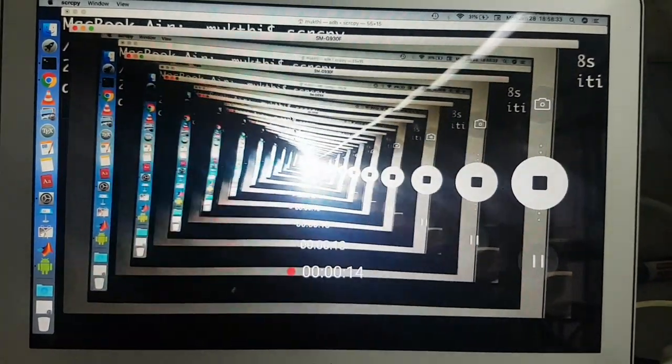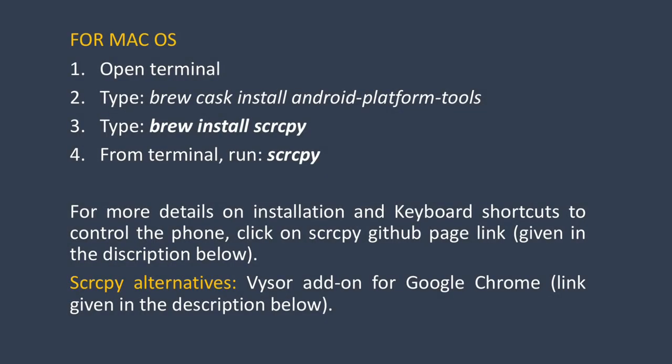So I was recording from the same phone which I have connected, and yeah, you can have some fun like that where you have some weird patterns. So like scrcpy, you can use any other app. I prefer scrcpy because it's smaller and can run on multiple platforms, but majorly because it actually has some really cool keyboard shortcuts like Control H for going to home or Control B for going back. And even in Supervision, you have the up and down arrow keys for zooming in and zooming out. So those things really help.